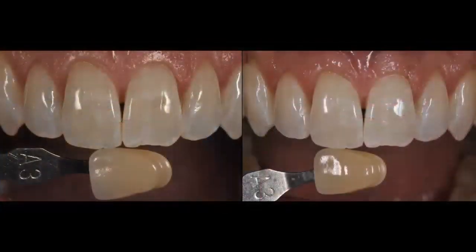Now, this is my second patient, and this is a patient that I told you that I was going to use 20% carbamide peroxide with reservoirs and a scallop tray. So this is a different treatment modality, different tray design. And the only reason why I'm doing a different tray design, one more time, is more saturated teeth. In my experience, you rarely see hypersensitivity on these teeth.